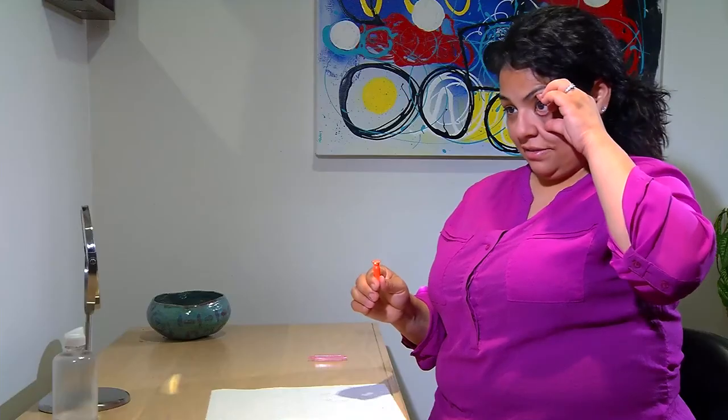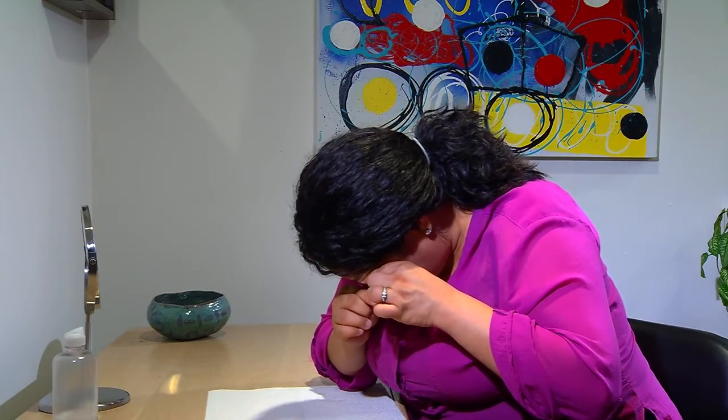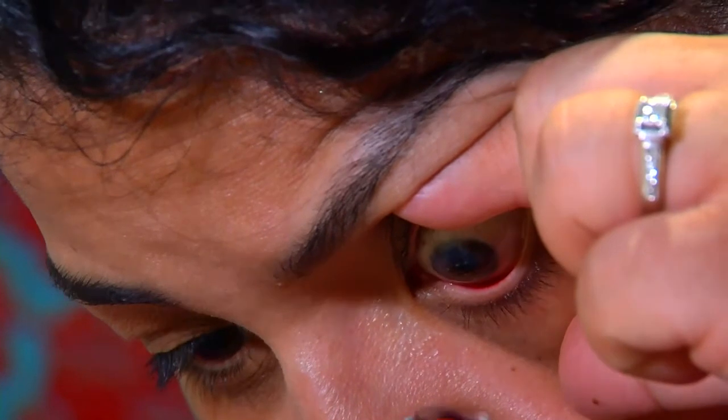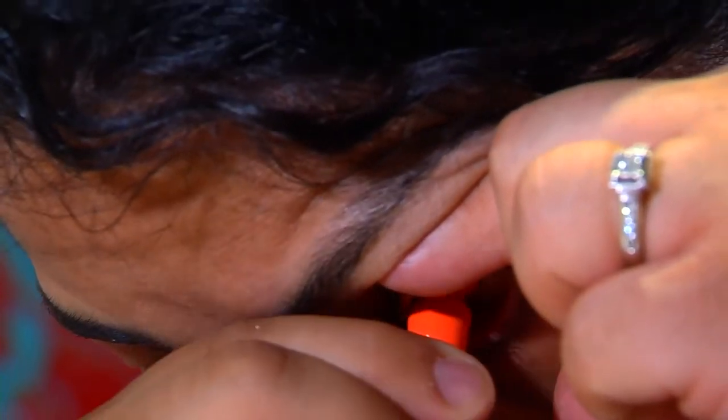Using your fingers, pull the upper and lower eyelids back to expose a large enough area of the eye to allow for easy application of the lens. Tuck your chin to your chest and tip your head forward so it's parallel with a flat, horizontal surface, like a countertop or table. Looking straight ahead at the flat surface, apply the lens so that the lens remains filled with saline. To remove the suction cup from the lens, gently squeeze it while closing your eyelids.